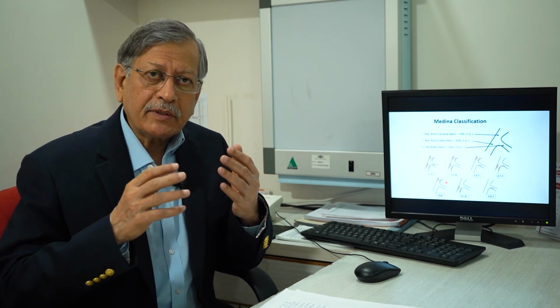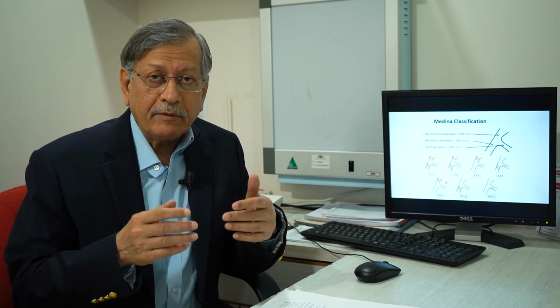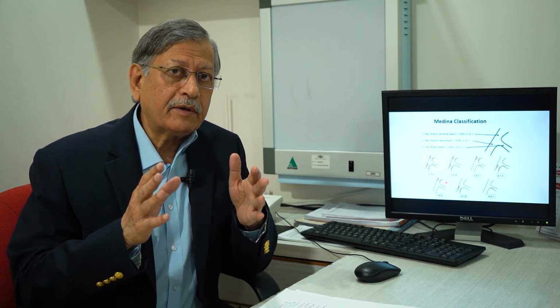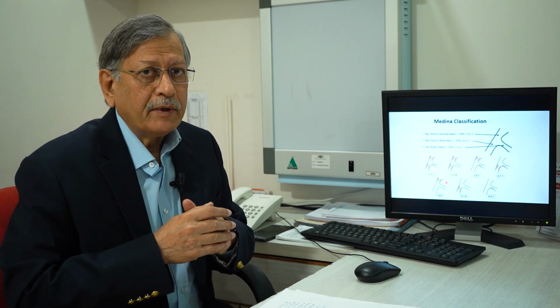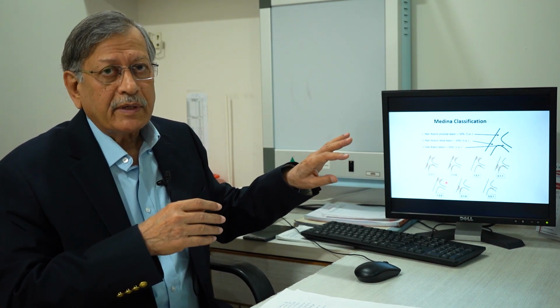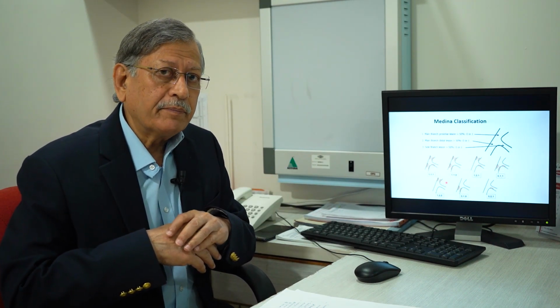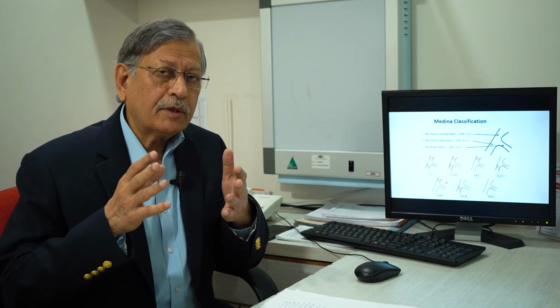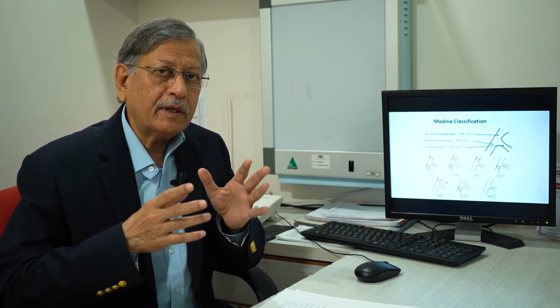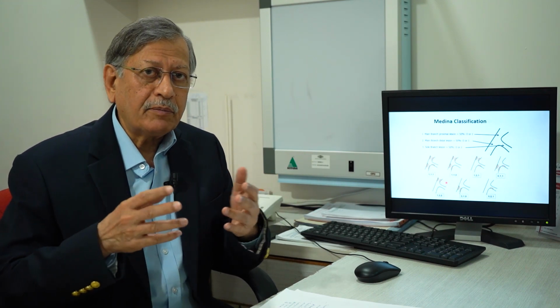So if there is any change during the procedure, we may have to adjust our strategy. We may have to go on plan B. So we have to have an open mind when we start a procedure. Never forget that things can change during the procedure. Whatever your plan may be, it may have to be reorganized and readjusted. So you should have gadgetry in your cath lab for all this adjustment that may be required.